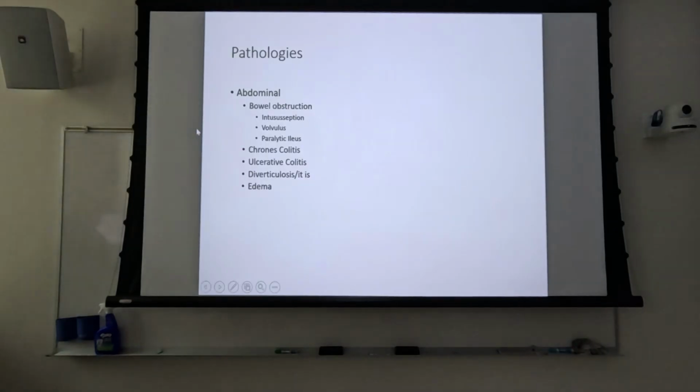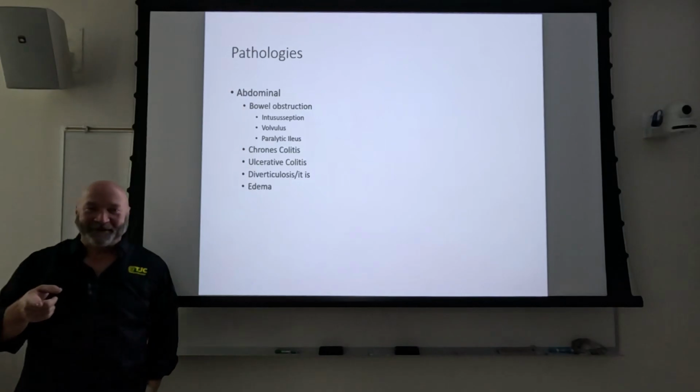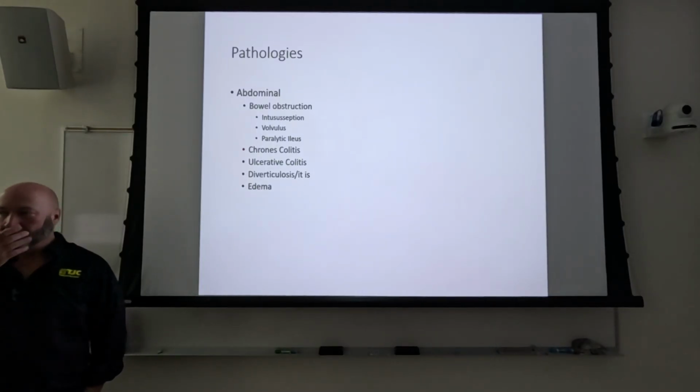So in the abdomen, bowel obstruction, what are your telltale signs of bowel obstruction? You walk into the patient's room for a KUB, you're doing it portable because you can't bring them to the department. They won't let you bring them to the department. You walk in, what are your telltale signs the patient's got a bowel obstruction? Well, first, the chart should tell you. Secondly, the nurse should tell you. But if you can't find either one of those, what are you looking for?